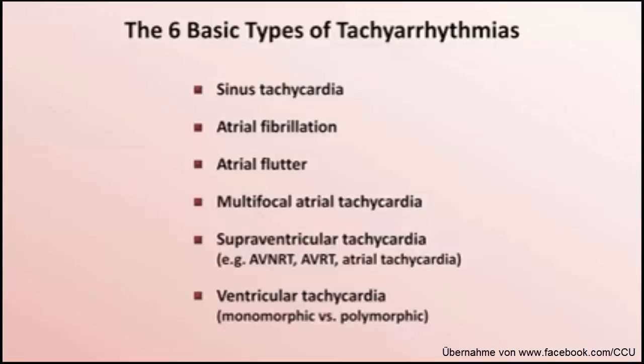The 6 questions will allow you to place any tachyarrhythmia into one of these types with 99% certainty.